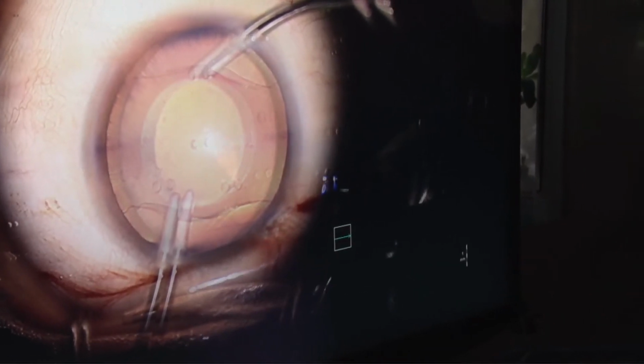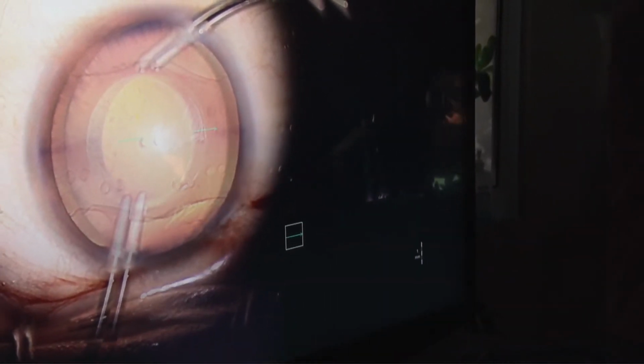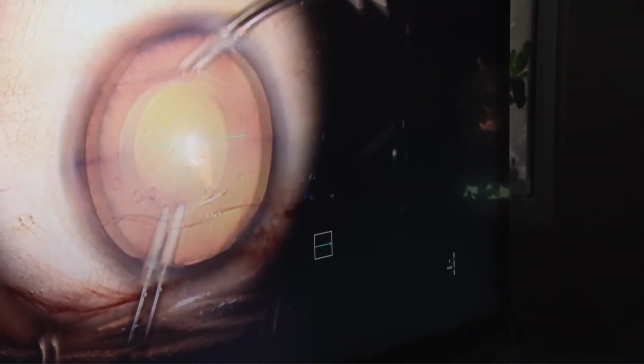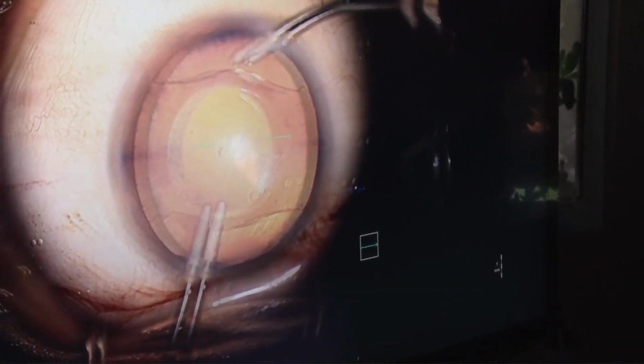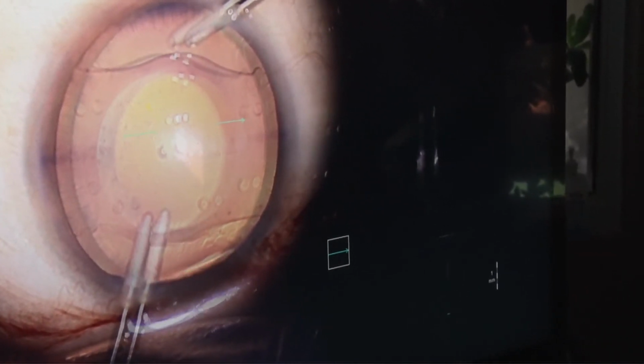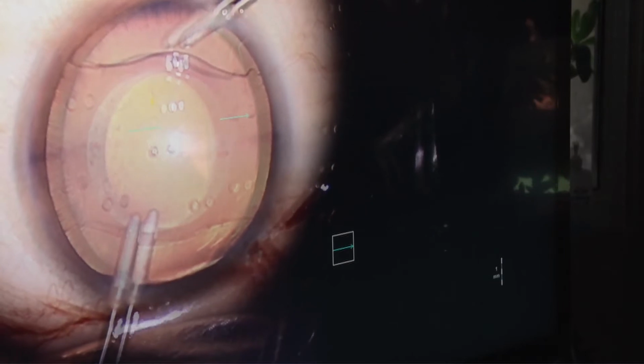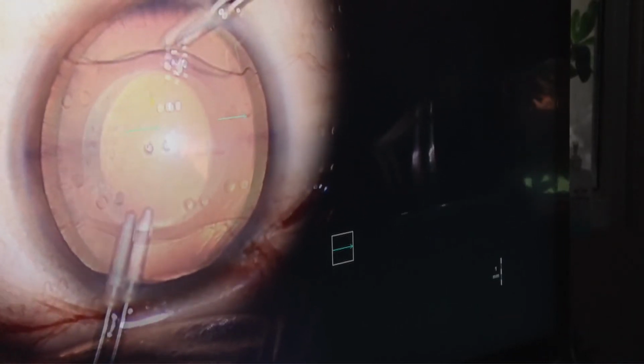So it's very important to get all the viscoelastic out. It's very, very important. Have you gone underneath the IOL or no? I don't go underneath it because the size of this IPCL is such that you can easily aspirate under it even from the side. As you can see, I'm doing now. My aspiration is just at the edge of the optic, and I'm aspirating just under the ICL.